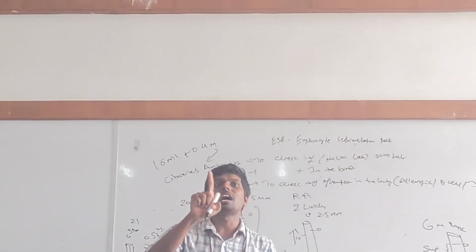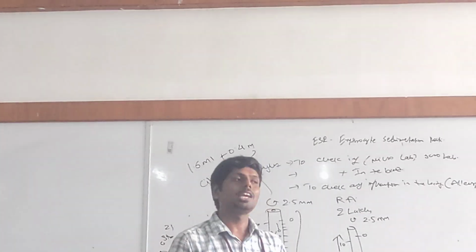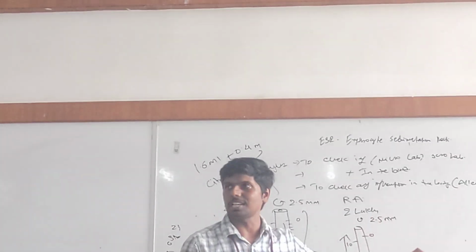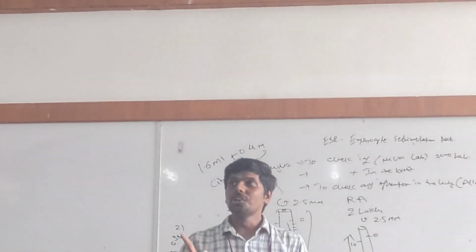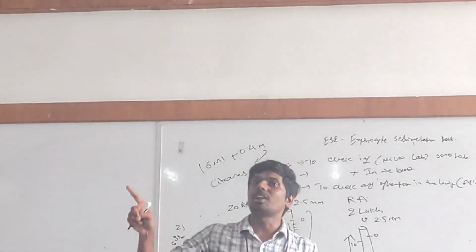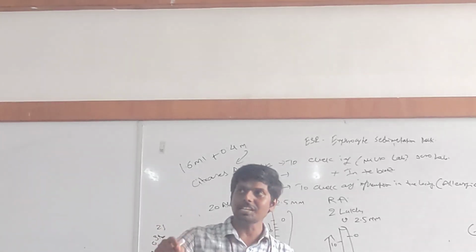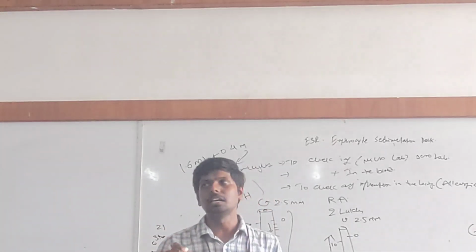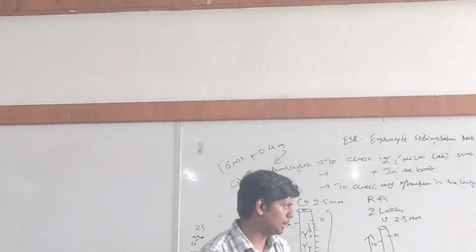One of the reasons is RBC count also. We need to consider some factors involving ESR, that I will discuss in the next lesson. But anyway, now you got a second connection with ESR. ESR also varies from gender to gender, condition to condition. We need to consider some factors before validating the report of ESR. Is it clear? Very good.